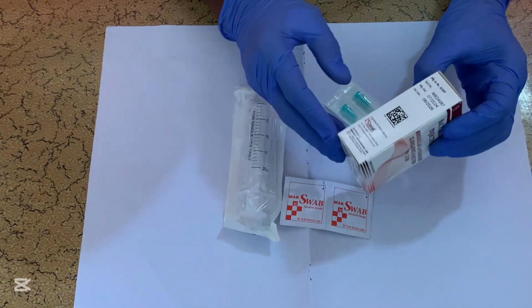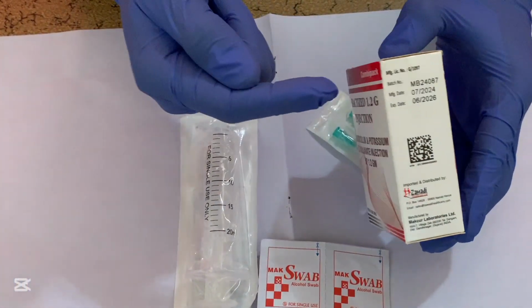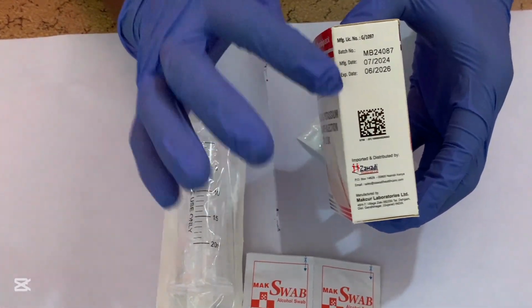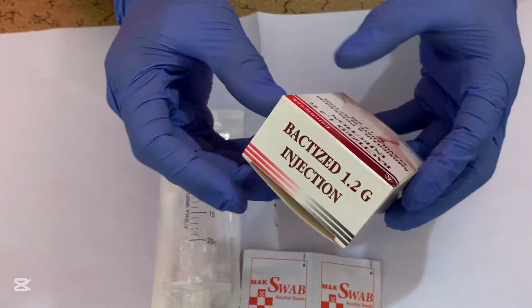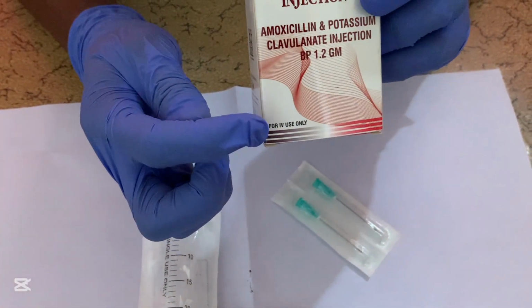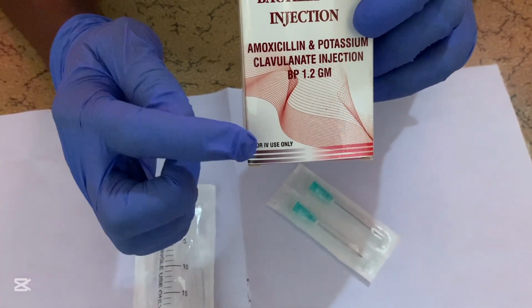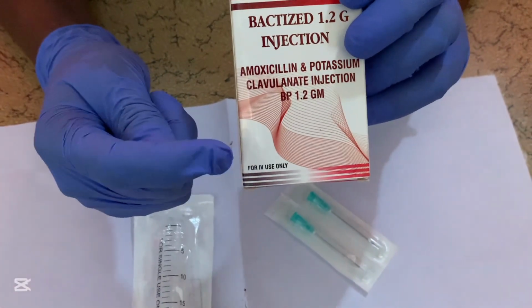Let us proceed. Before you start diluting the drug, make sure you check the expiry date of the drug. For example, the expiry date is June 2026. Then check the method of administration, for example, for IV use only. This drug can only be administered through IV use.